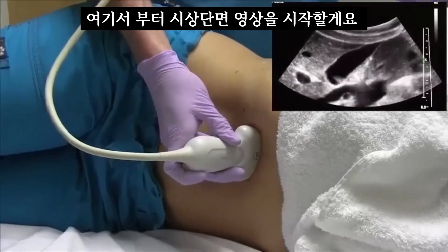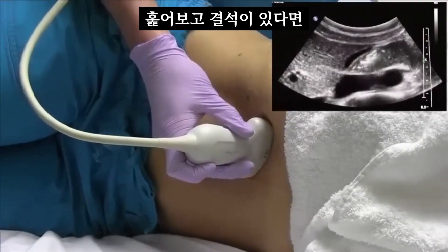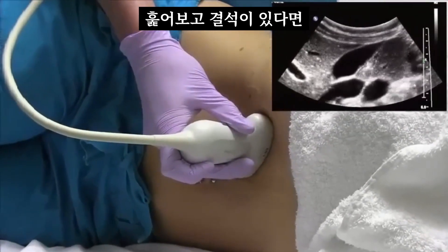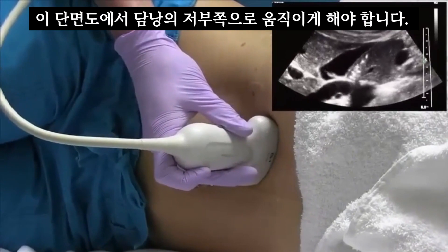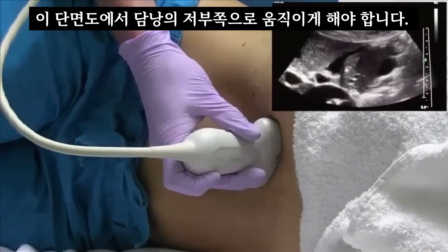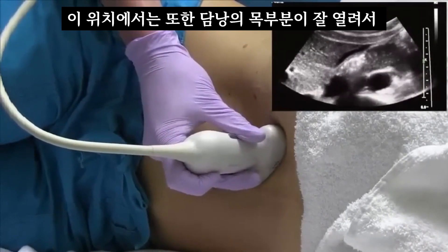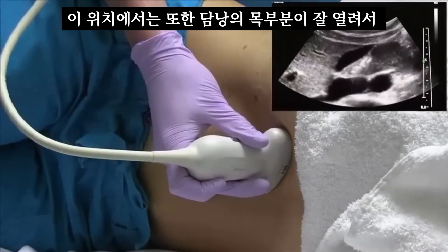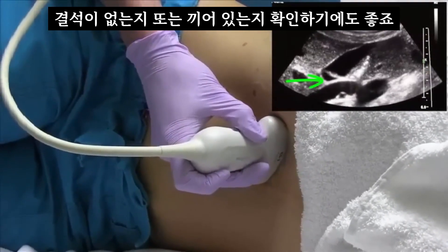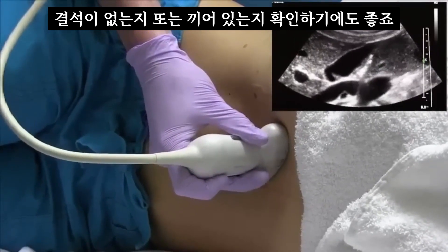I like to start in a sagittal plane from here. If there are any stones, they should drop into the fundus of the gallbladder from this plane. This is also good for opening up the neck of the gallbladder to make sure there are no stones impacted in the neck of the gallbladder.